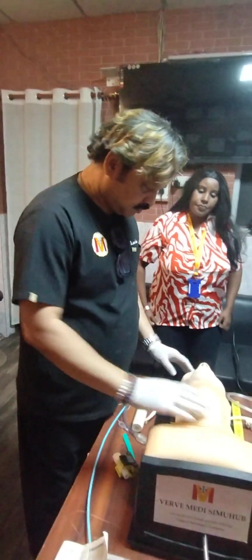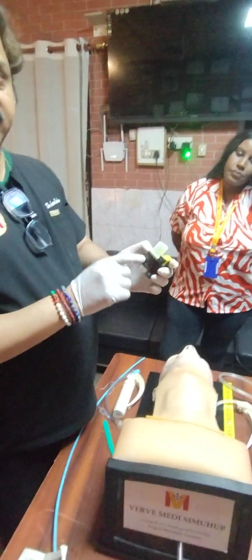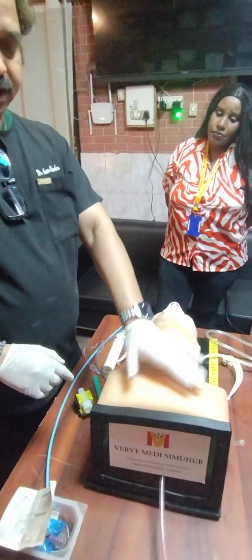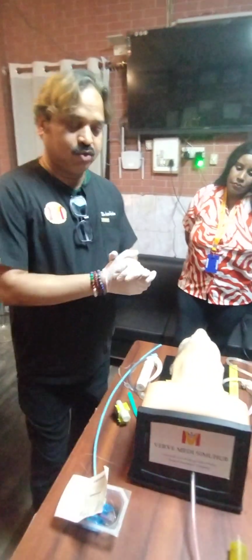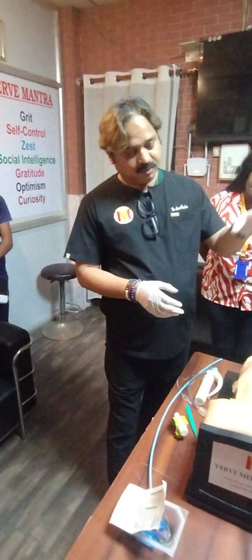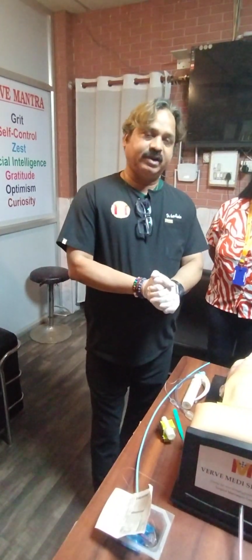Okay, then we have given in this mannequin, so when you are able to intubate, it will give you a capnograph. Okay, it will give an ETCO2 number, and then it has got chest rise, which we will demonstrate. And this is the tubing through which if you breathe, then it will give a capnograph, and through this also we can create vomiting. So if you want to make it more stressful, then apart from difficult intubation, you can throw some vomitus inside the oral cavity, and that we will demonstrate.